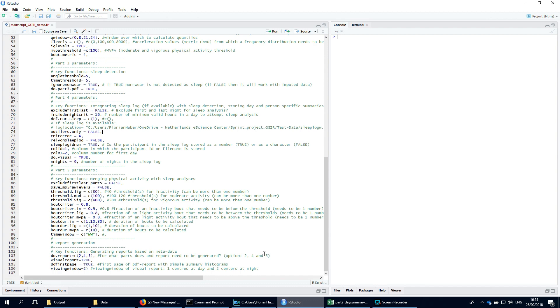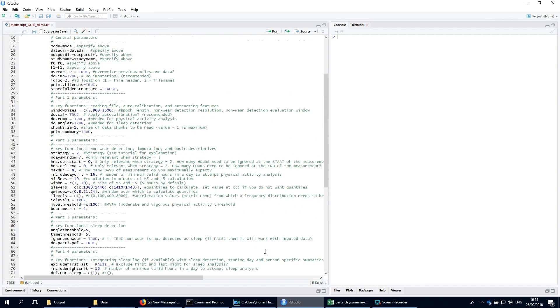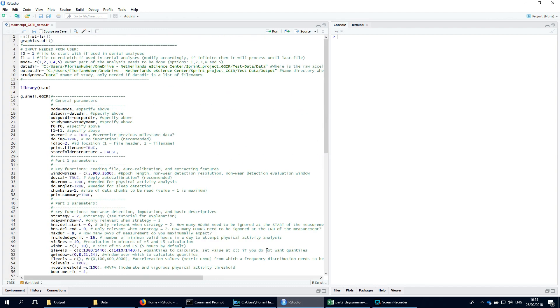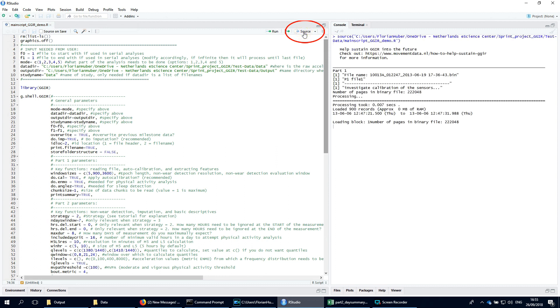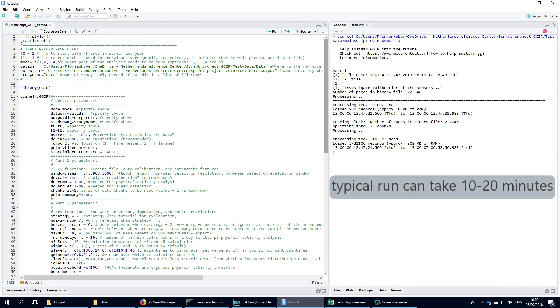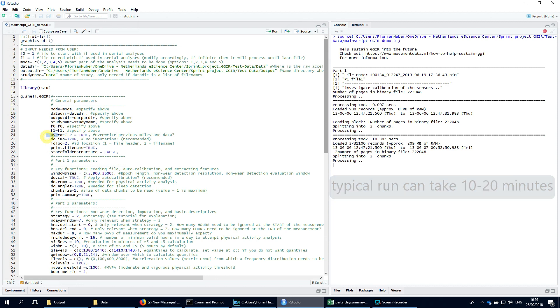Once all parameters are set, we can start analyzing the raw data using the source button in RStudio. Especially deriving the milestone output from part 1 can take a while. The typical duration of processing an acceleration file with all 5 parts is between 10 and 20 minutes, depending on the specifications of your computer and the duration of the recording you are working with. Often this only has to be done once.